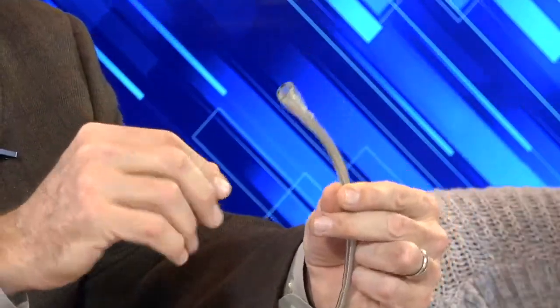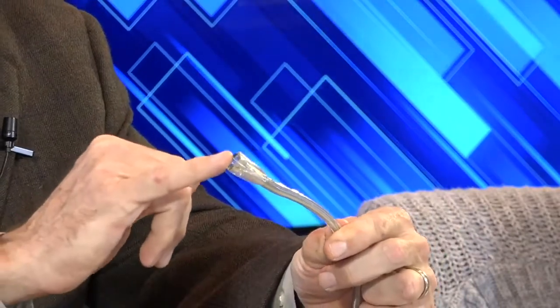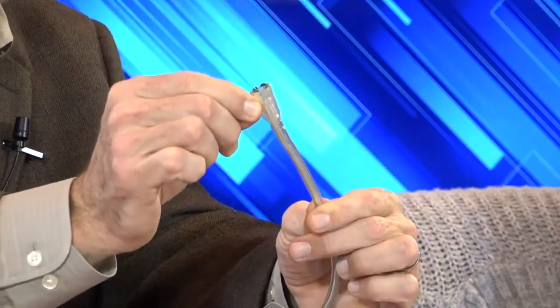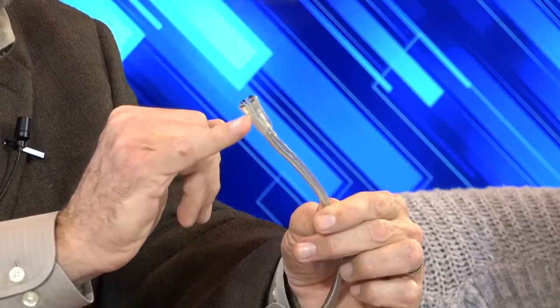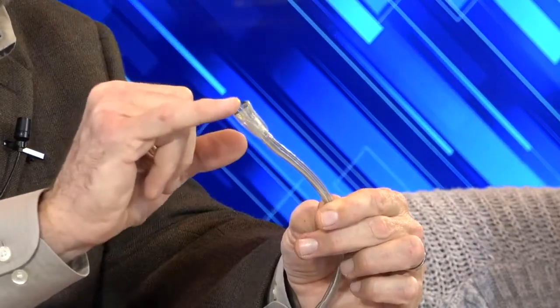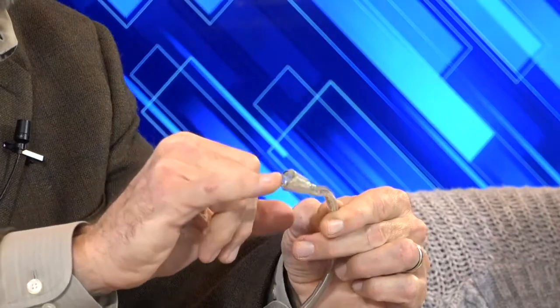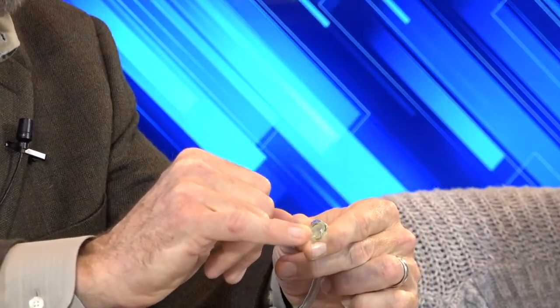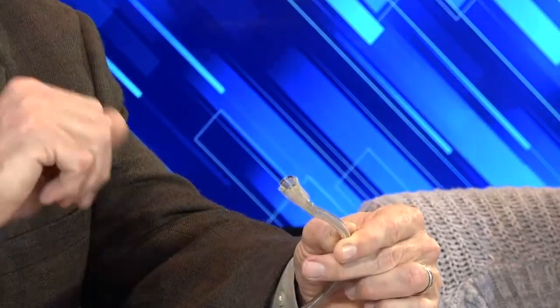So this is our Generation 2 cannula. Can we go back? Here we go. So we had radiopaque markers that we added to the distal end. You can see that there's an outer balloon, and the inside of here is an inner balloon that actually works to inflate and separate the petals to create a funnel right there at the end. Now, the more fluid you get in there, up to roughly one atmosphere.